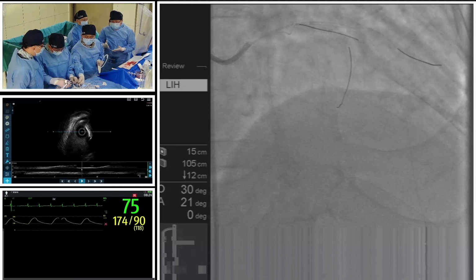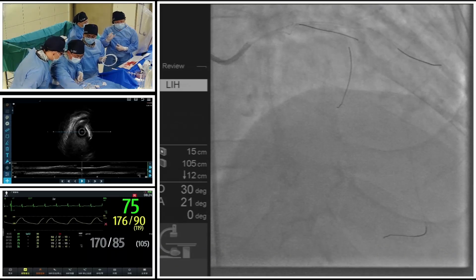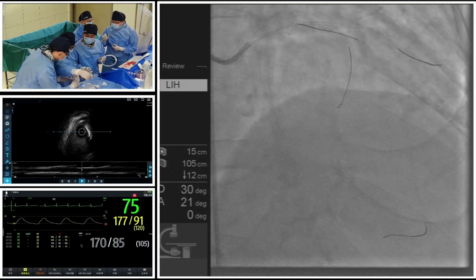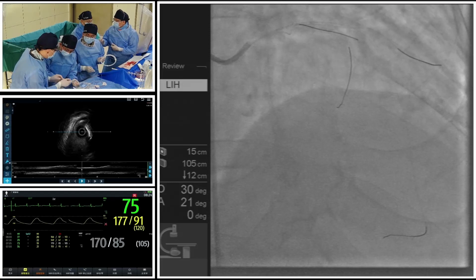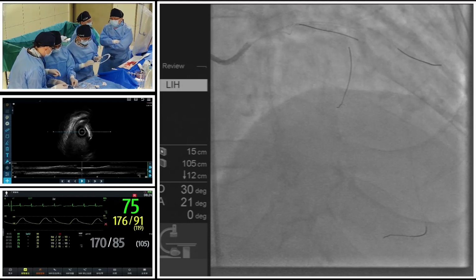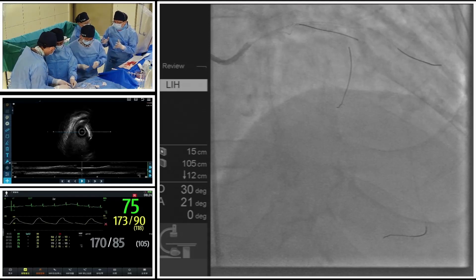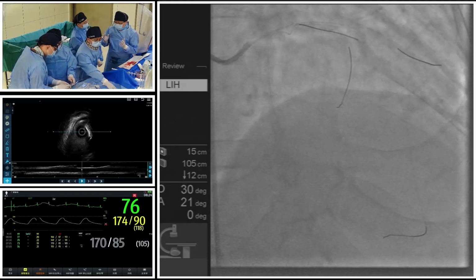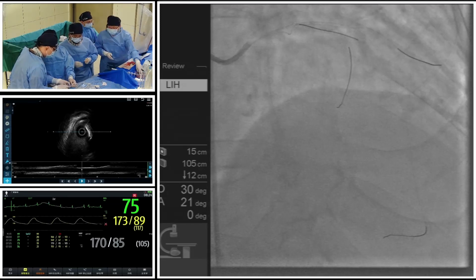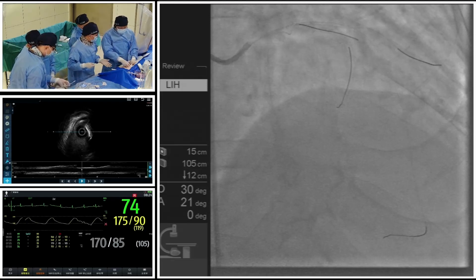So the shockwave should be performed most at a little bit distal to the ostium of the LAD, and in that place the panoramic vision system already shows us a 270 degree calcification embracing the LAD.